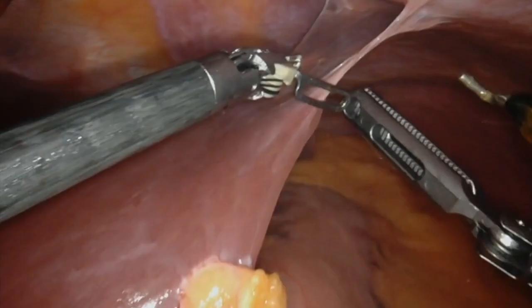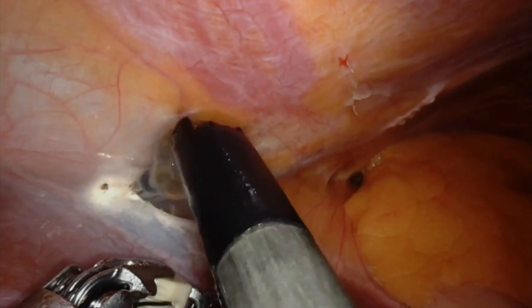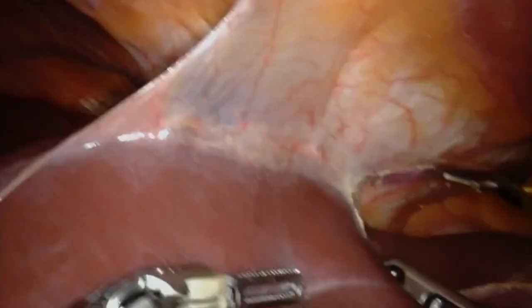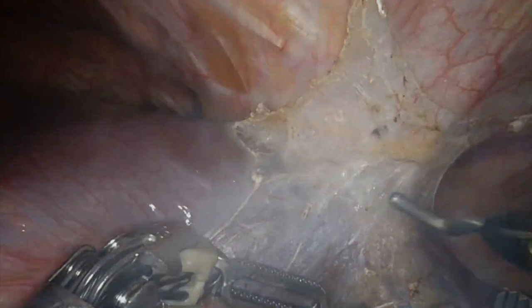The operation started with liver mobilization by taking down the adhesions. The left coronary and triangular ligament were taken down with the robotic hook cautery as well as bipolar graspers. The falciform ligament was also taken down all the way up to the hepatocaval confluence. The dissection was done very carefully so as not to injure the left hepatic vein.